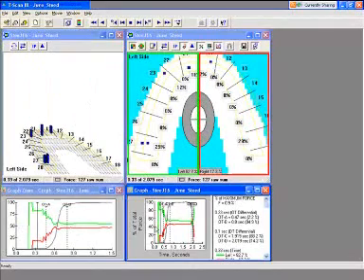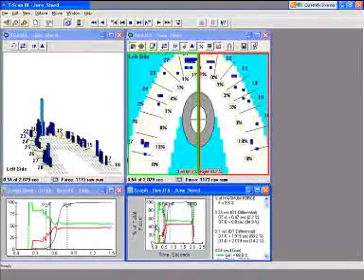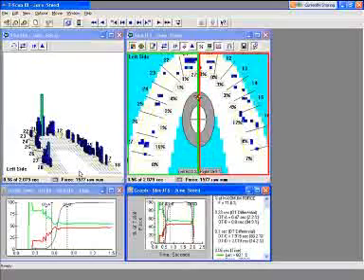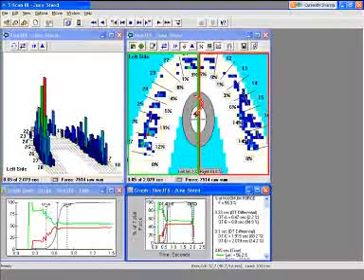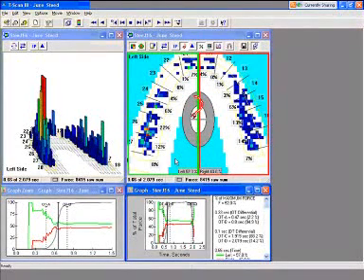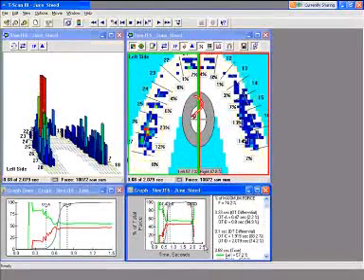If I'm to play the movie through for you, use your arrow key. Okay, you see very quickly what happens. This tooth comes into contact, so keep that in mind when you're using your assessment. So if that tooth hit contact first, then I go kind of to center, and this is all in time. Paper can't do that. And then all of a sudden this red spike shows up over here in the upper left molar region. And look at how quickly these several red come into play.